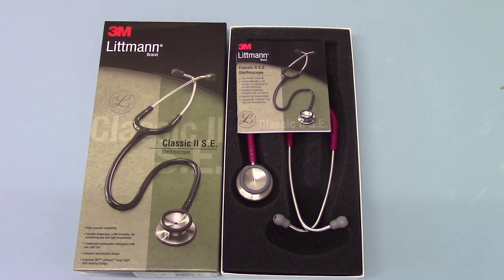Welcome to this product demonstration. We're going to show you today the Littmann Classic 2 SE stethoscope. This is standard UK box packaging from 3M Littmann we're showing you here.